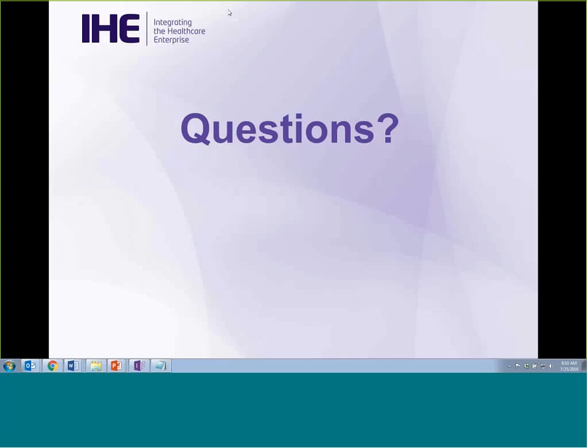Go ahead, Mike. Okay. So, Kevin, there's a question for you in the chat box. Can you see it? Let's see. Oh, yeah. There was one earlier from Radi at InfoWave, asking whether there was a unique identifier for each of the remote reading tasks, and it was one of those great queue-up questions. I think on the next slide we got to that. So yes, each resource has a unique identifier, and that lets you target any post or get messages to the appropriate work item. Okay.